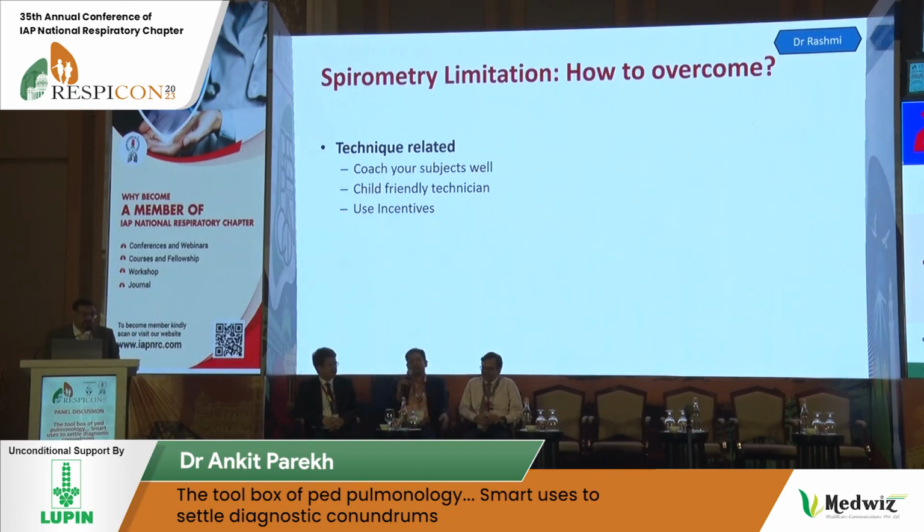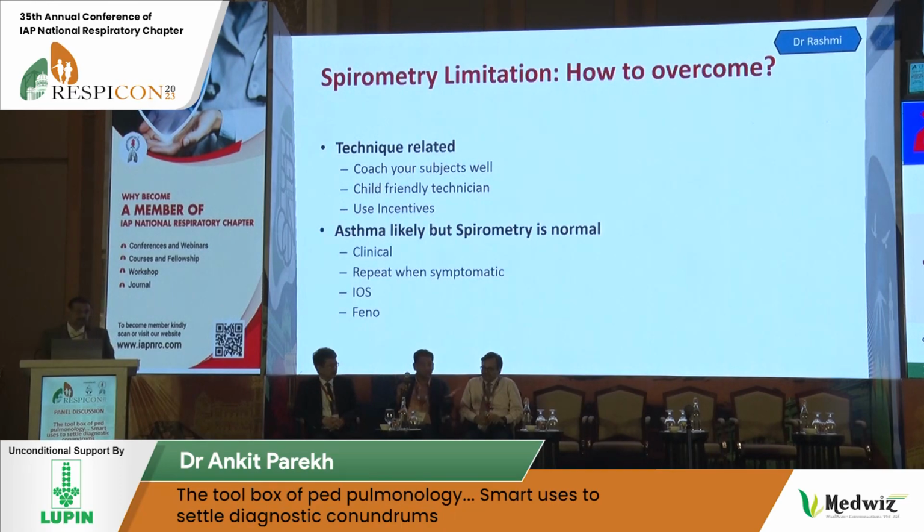Another point, you can ask the parents to do it first and then ask the child to do it. Sometimes children fear the instruments, thinking something might happen. If the parent is doing it, they will get motivated to do it. Another point, you can give some reward: if you do this in this way, you will get some reward. So these are the incentives you can employ.